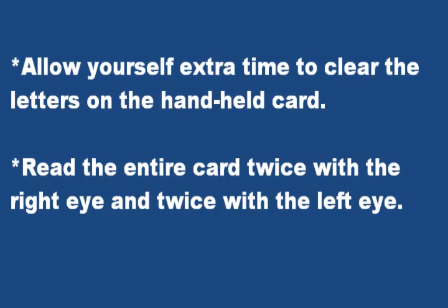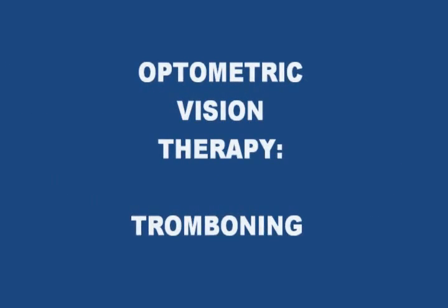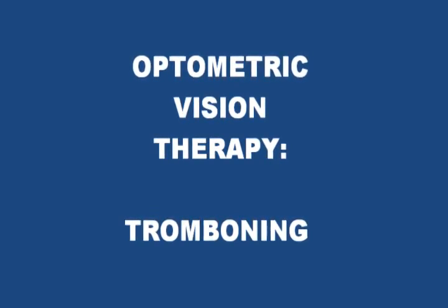Allow yourself extra time to clear the letters on the handheld card. Read the entire card twice with the right eye and twice with the left eye. Tromboning is the second way to perform heart chart accommodative rock vision therapy.